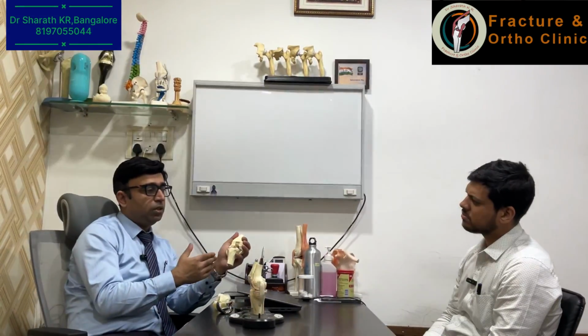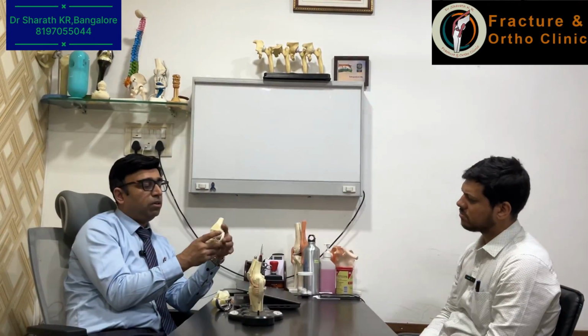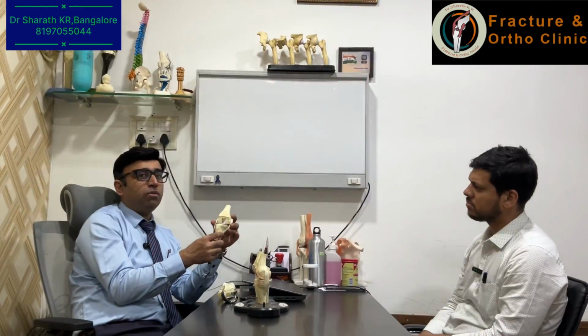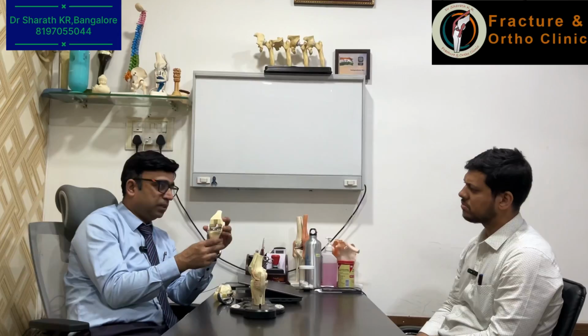We use our instruments or company instruments during the surgery. We use robotic instruments. These instruments help us give better accuracy, better alignment and better balancing of the ligaments in order to have a better overall outcome for the knee replacement. That is the difference. So how exactly is the robotic knee replacement done, sir?